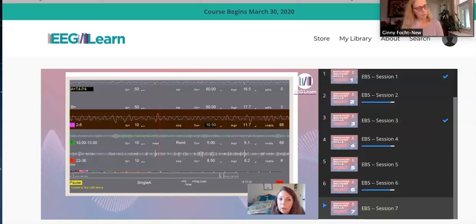The other reason why we want to really watch that 2 to 6 hertz activity with a T4 minus P4 hookup, or any bipolar, any slow wave inhibit with any protocol that you're using with a developmental trauma person, you do want to watch the slow wave activity, because that's the range where dissociation and flashback occurs.